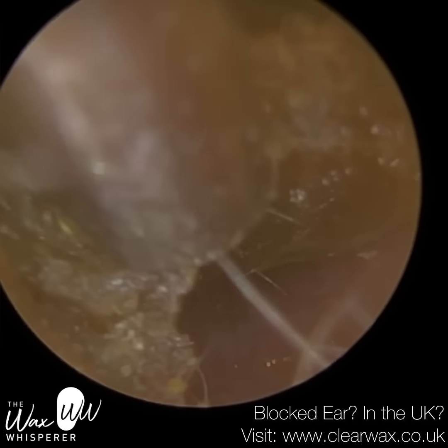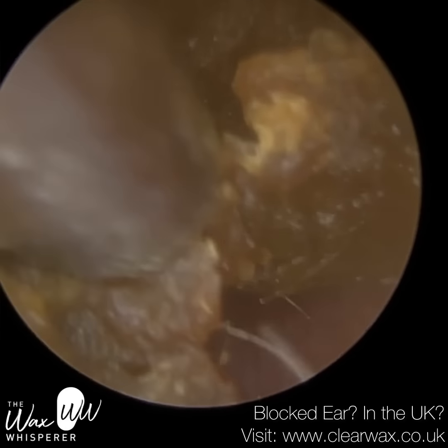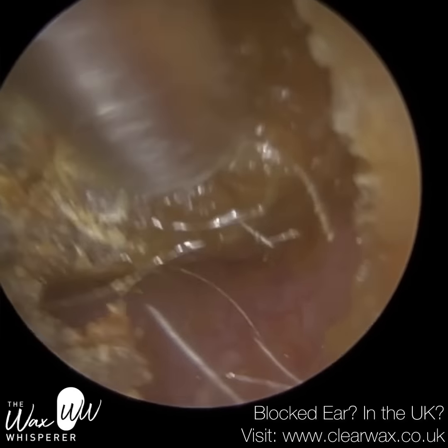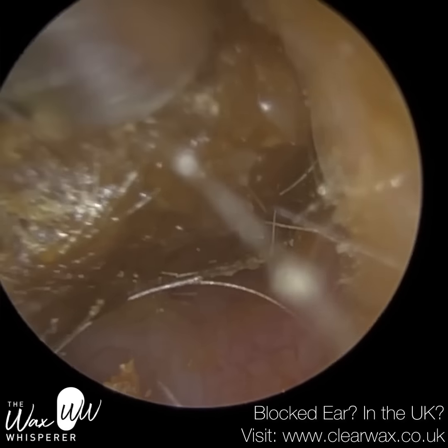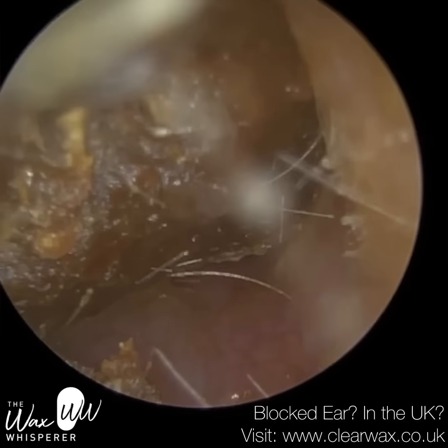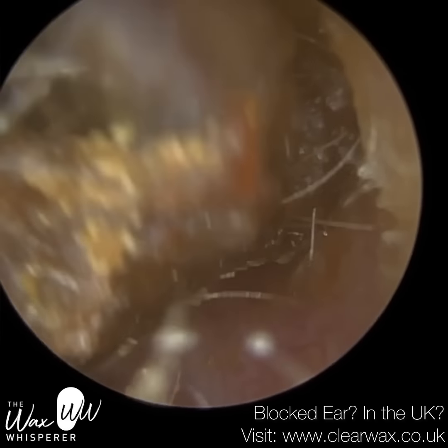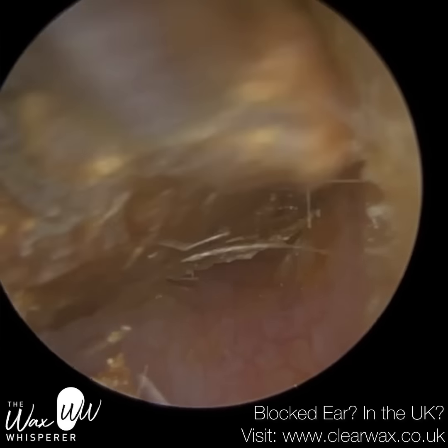Now the patient's got quite dry skin, particularly at the entrance of the ear canal, in their conchal bowl. The flap of cartilage on either side of our head, we call that the auricle, also known as the pinna. And just adjacent to the entrance of the ear canal, you've got this bowl — we call that the conchal bowl. There are two segments: the cymba concha, which is the top part, and the cavum concha, which is the main body of the bowl. The patient's skin there is quite dry — a bit of superficial otitis externa.